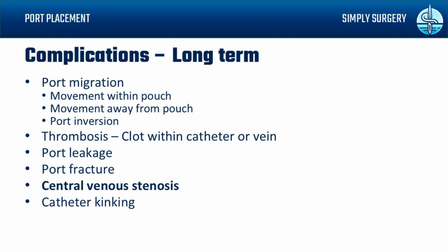A long-term complication of administration of the medications itself, not from the port, would be central venous stenosis. And that's just because the things that we generally put through ports, like chemotherapy, are very toxic and damaging to the veins. And that's why we're going through central veins in the first place.